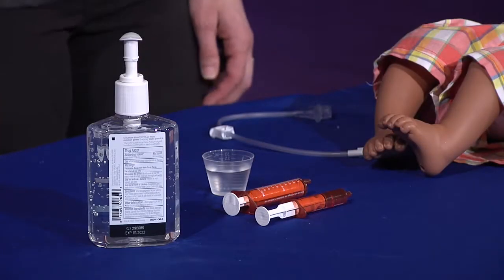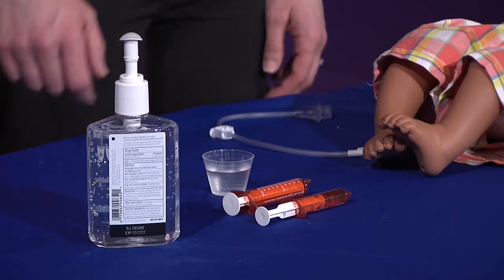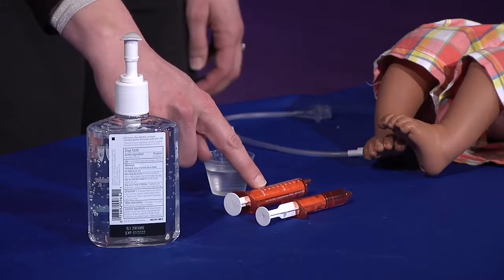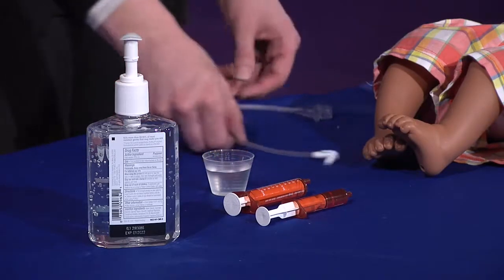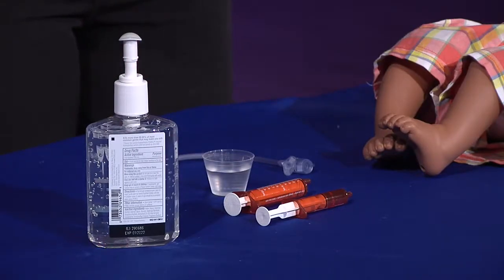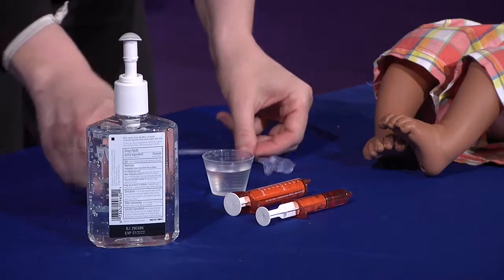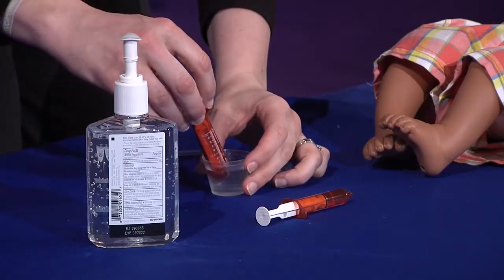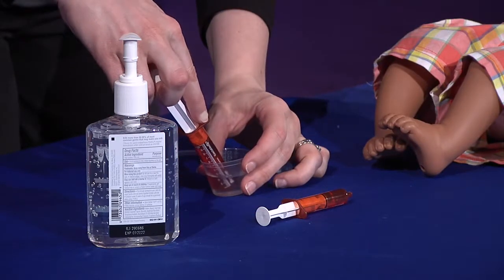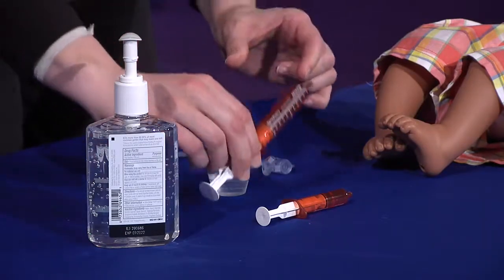In order to flush your child's G-tube and give medications, you will need the medication, a syringe, water, and the extension tubing. Be sure to wash your hands first. Then, fill the syringe with the amount of water prescribed by your healthcare provider. In this case, we will use 10 mL or milliliters of water.